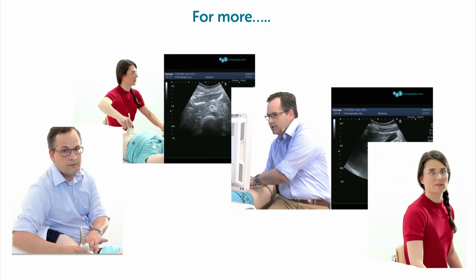Still, this is not the main topic of our course, and we have a complete course on abdominal ultrasound as well. And I would highly recommend you to watch this course as well, and this is a topic that will be covered there, definitely. So we talked a lot about transthoracic echo. We still have one more modality to talk about, and that is TEE. Anna, what is the role of TEE?